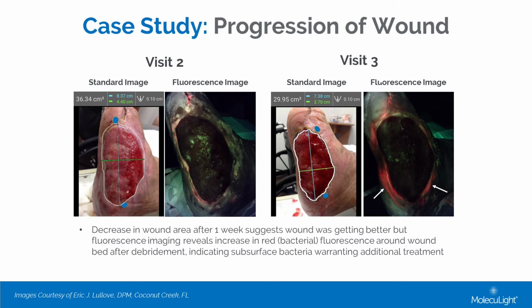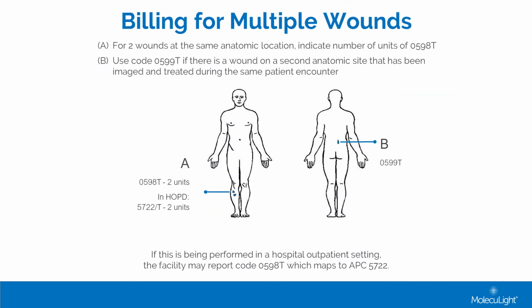And that just continuously indicates to the clinician that you have to do a better job not only in exudate management, but also in your debridement technique. But what you can see from week to week is a reduction of almost 6 square centimeters in surface area. And this is partly because of identifying where there's bacteria and being able to remove and treat that bacteria on a week-to-week basis at point of care.